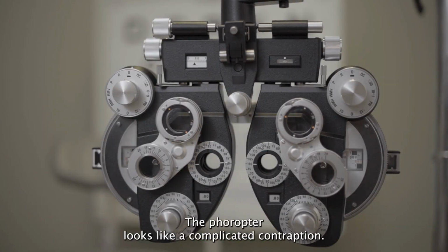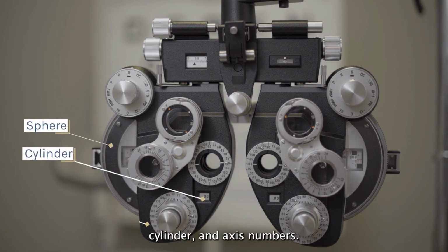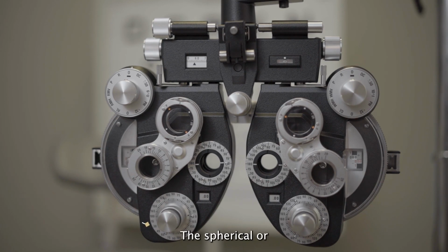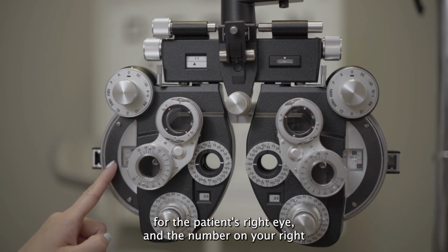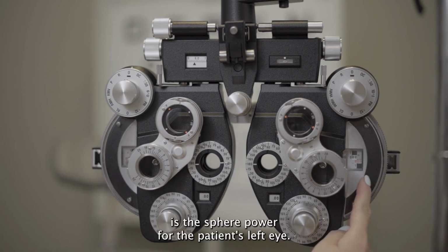The phoropter looks like a complicated contraption. To simplify what you're seeing here, let's first focus on the three areas where you see numbers for the basic prescription: sphere, cylinder, and axis numbers. The spherical or sphere power is usually located on the far right and left of the phoropter. The sphere number on your left is the sphere power for the patient's right eye, and the number on your right is the sphere power for the patient's left eye.